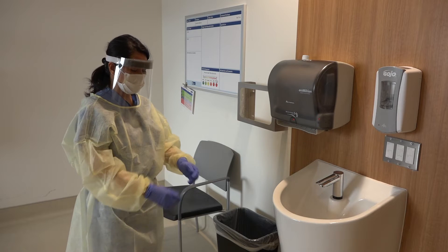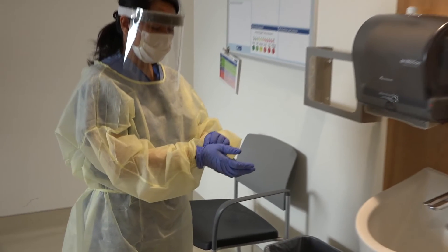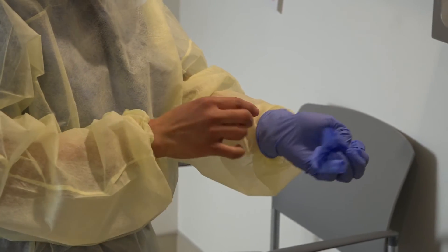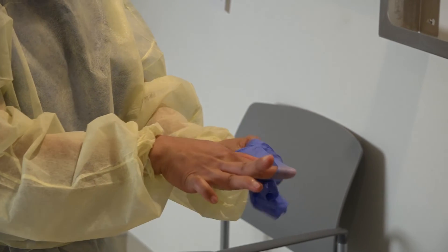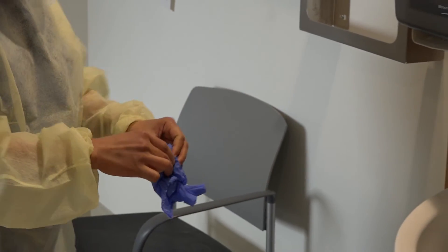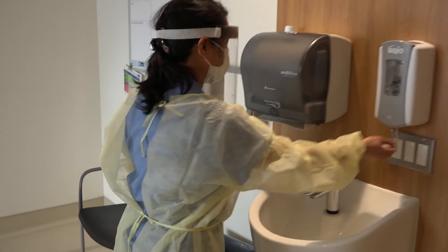We will now go over appropriate doffing technique. The first thing that she will remove is her gloves. Note that she is careful to remove them in such a way as to not contaminate her hands. She reaches under the glove and peels the gloves off and then throws them into the garbage. She will now perform hand hygiene.